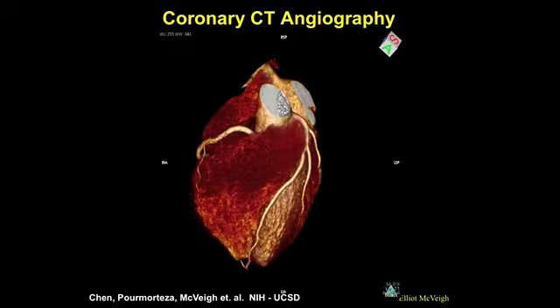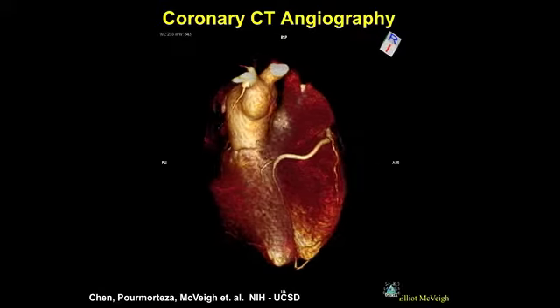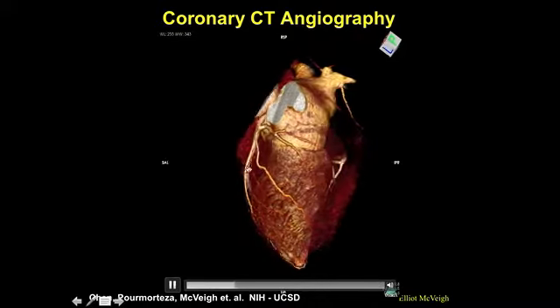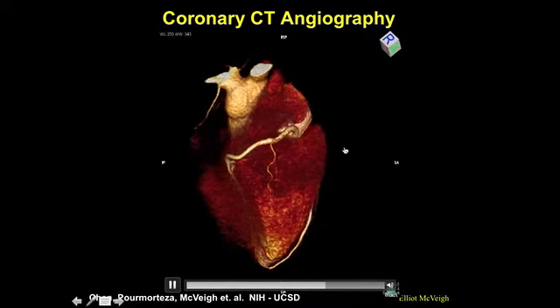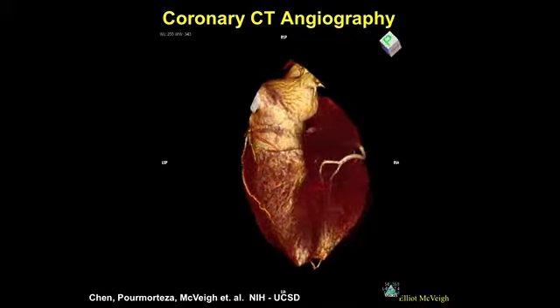But it's a number. And so the relative brightness of those numbers can get mapped and you can make a rendering. Very bright things in this image are inside the vessels, right? All those things are vessels because the contrast agent is running in the vessels and it makes them brighter than the surrounding tissue. So we can eliminate the surrounding tissue and just look at the vessels.